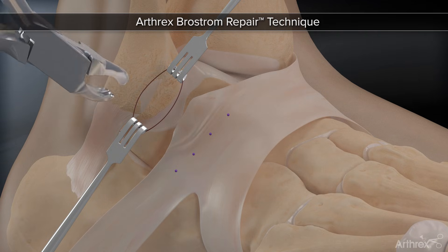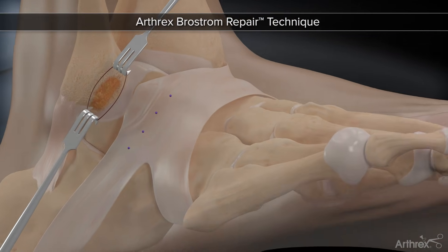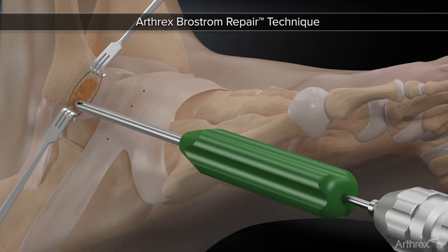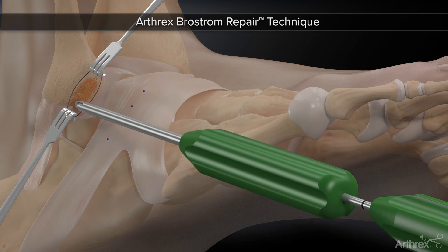Using a rongeur, remove the cortical surface of the distal fibula to expose the cancellous bone. Next, orient the drill guide 5 mm proximal to the distal tip of the fibula. Being cognizant of the 3D anatomy of the fibula, the preloaded 3.0 mm biocomposite suture tech anchor is pre-drilled and inserted through the guide.